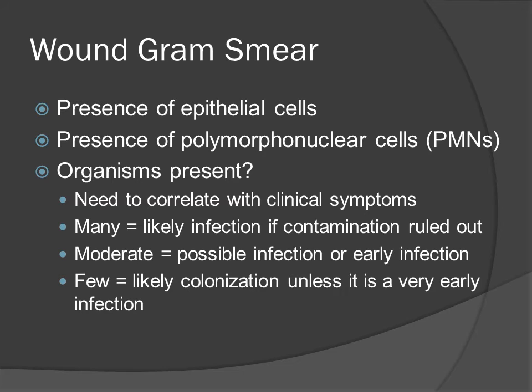When you're looking at a gram stain or a smear for a wound culture, you're going to want to look at multiple different things. Right now, not all these things are being reported by microbiology, but Venga and I are going to pursue seeing if some of these things can start to be reported, because it really helps with our interpretation of whether the wound culture is positive or colonized versus contaminated versus an actual pathogen.